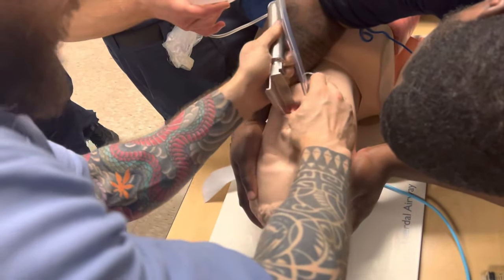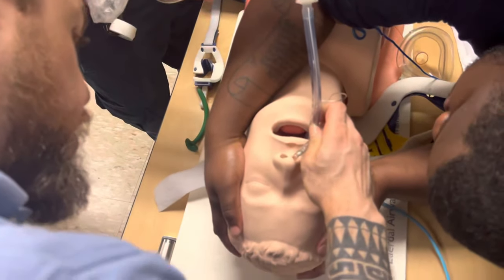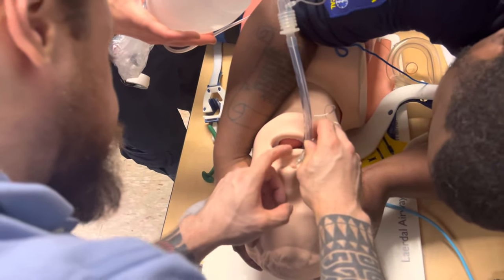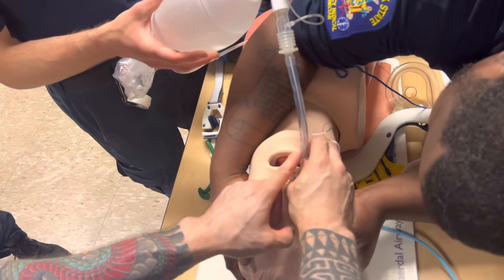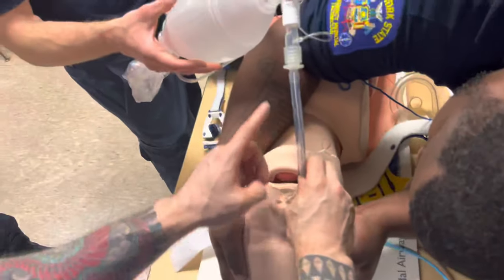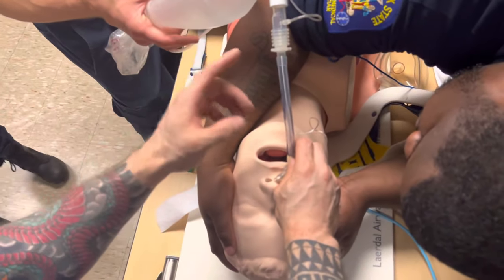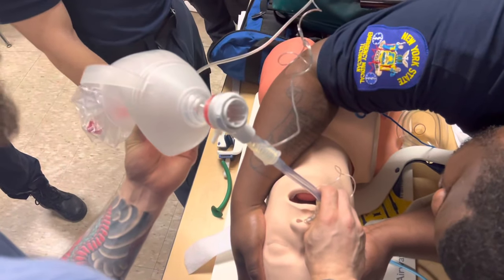I hold it and I'm going to note it's at the marking. This should be three times the diameter - this is a little too shallow for this person. This was an 8.5, so I would want to go deeper - maybe 22, 21-22 at the lip line. Once ventilation starts, I want to first get my objective data - 45, 35, whatever the number may be. And I can see expansion.